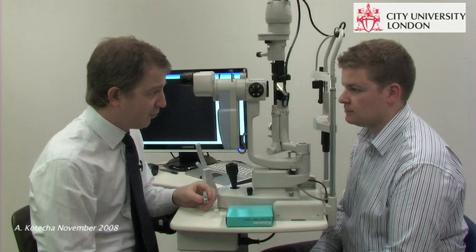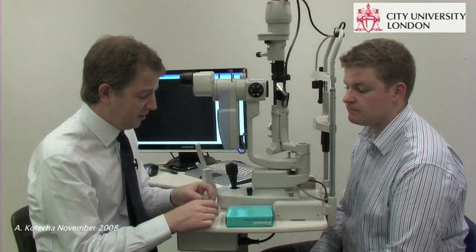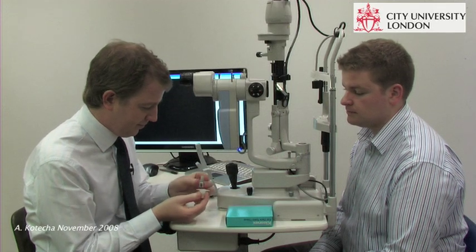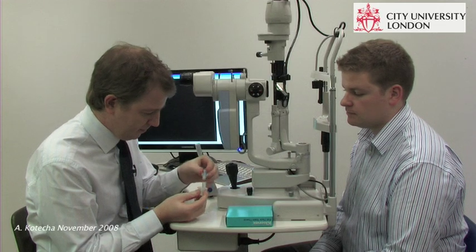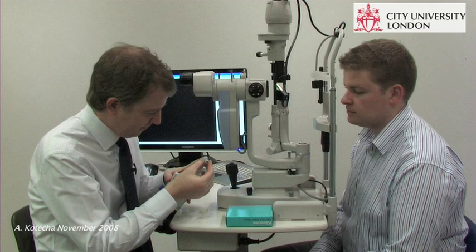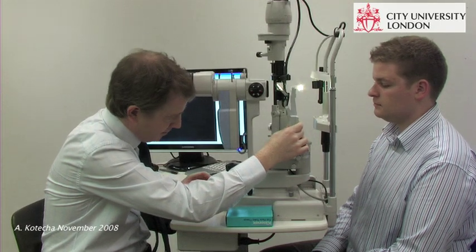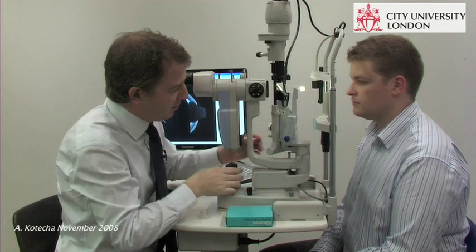Now I'm going to check the pressure of your eyes using the dynamic contour tonometer, and to prevent cross-contamination I'm going to use a silicone tip. And I'm going to place this in the device and mount it on the slit lamp, ready for use. And if you could come forward, please.